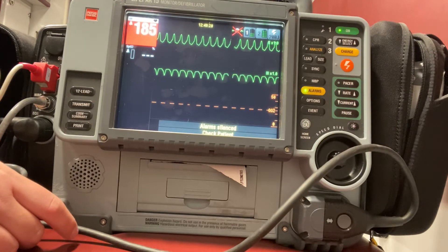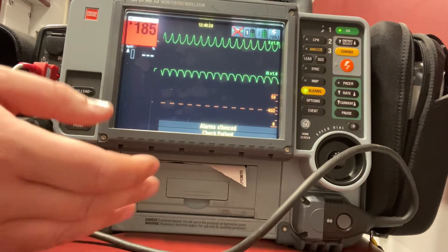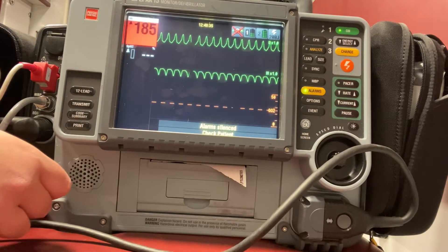If this were an SVT, I would start off at 50 to 100 joules. If I started at 50, my second would be 100, then 200, then 300, and 360. But this patient's in VTAC, so my first delivery is going to be 100 joules.